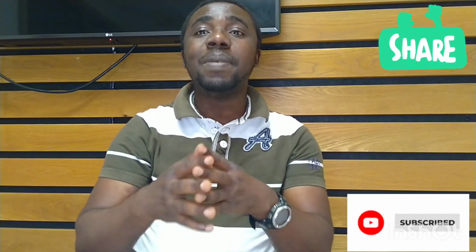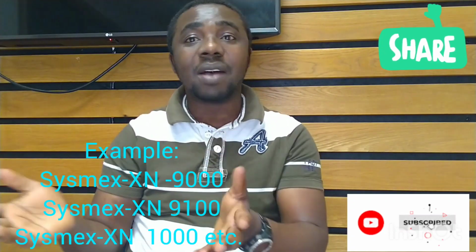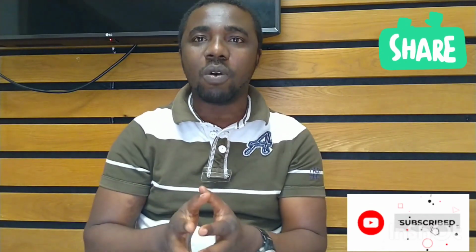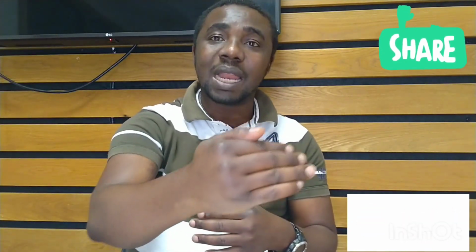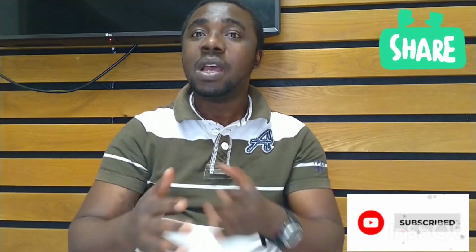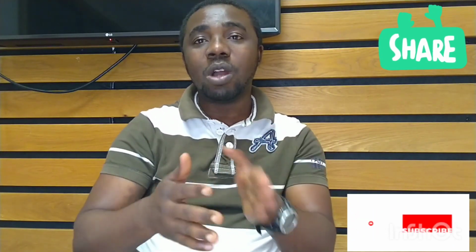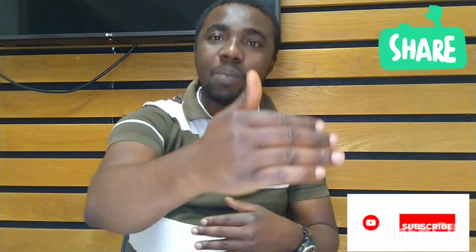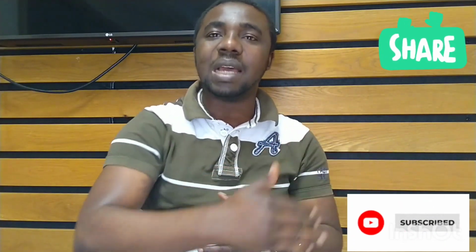That will be maybe the Sysmex XN 9000, Sysmex XN 9010, as the case may be. There are different codes for it. So it will then move on, depending on how many analyzers the hospital has. Some people might have 3, some have 2, some have 4, some have 5. So the more the analyzers, the longer the line will be. This rack will start moving from one analyzer to another analyzer and all of that.